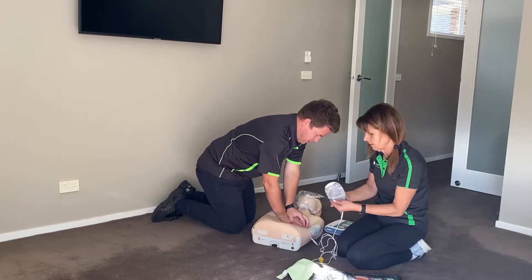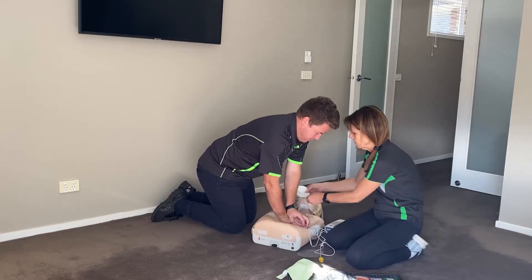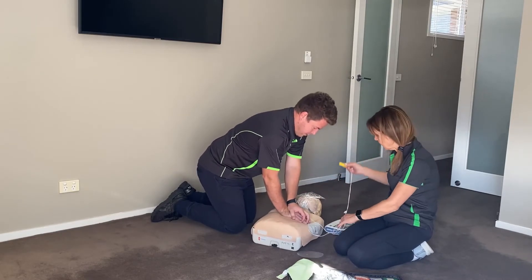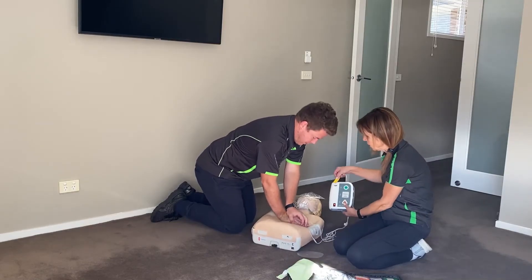Apply pads and plug in the connector. Once we're ready, we plug the defibrillator into the flashing light.